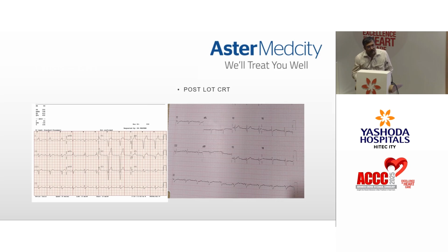In the usual CRT, the biventricular synchronization happens in a different way, from the epicardium and RV on another axis, so it's not a true synchronization. Here, when you pace at the base, it's a true synchronization on either side of the LV, and you can probably control the AV synchrony and VV synchrony better with a LOT CRT.